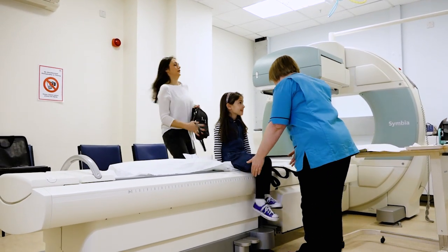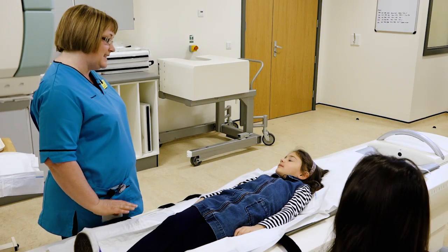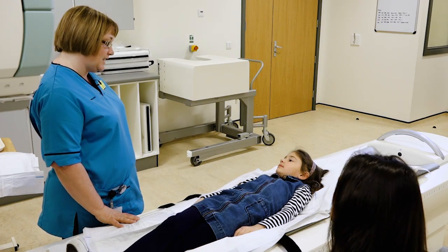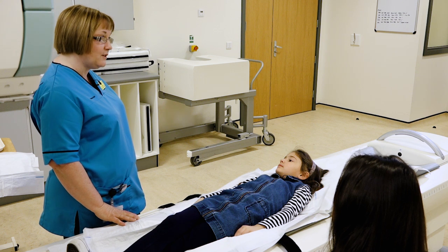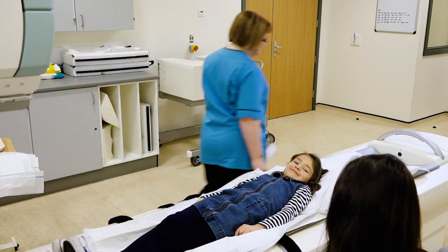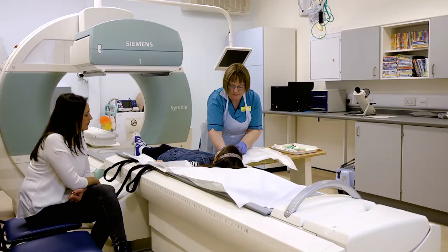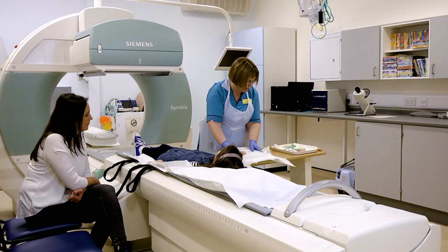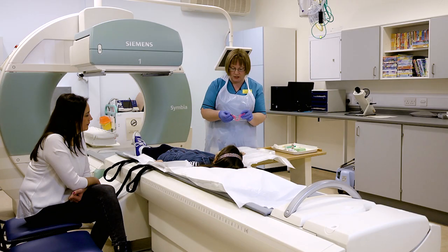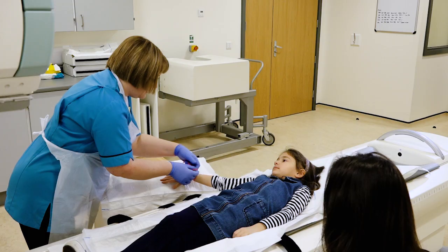So what we'll do is we'll get you up onto the table and we'll get mum to have a seat. When we do a DMSA scan, we have to give a small injection. First I'm just going to put some gloves and an apron on. The first thing we do is get you to put your hand on the table, and then we put this tight band around your hand, which squeezes your hand and makes your veins stand up nicely for us.